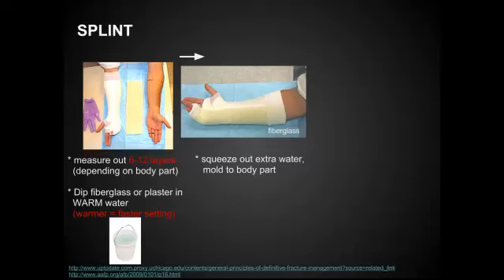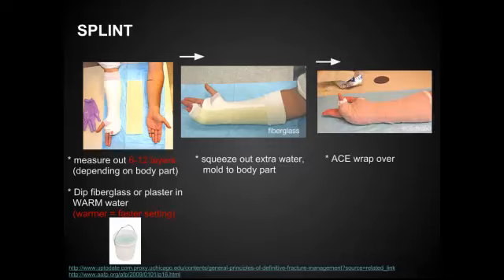You can see here that they folded down the stockinette over the ends to make sure that there are no sharp parts sticking out that could scratch the patient. Next, use the ACE wrap over the entire thing to hold the splint in place. Make sure you're not wrapping this very tight — the ACE wrap itself creates quite a bit of pressure, so do it just tight enough to hold everything, but not so tight that you're losing circulation to the digits.